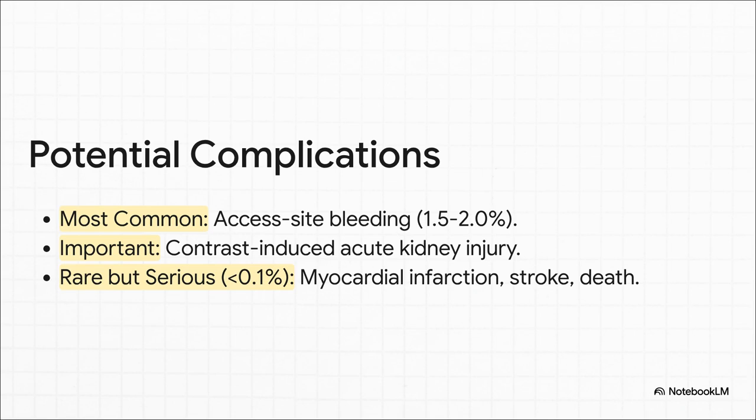The things we see most often are related to the access site, like bleeding or a bruise. We also have to be really mindful of the kidneys, because the contrast dye can be tough on them, especially in patients who already have kidney problems or diabetes.